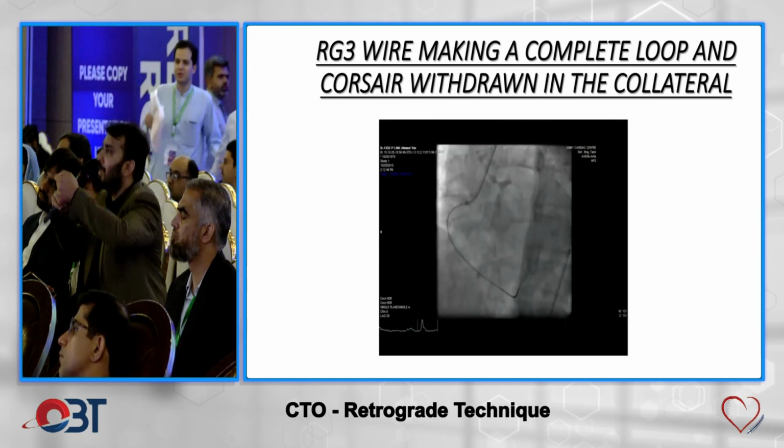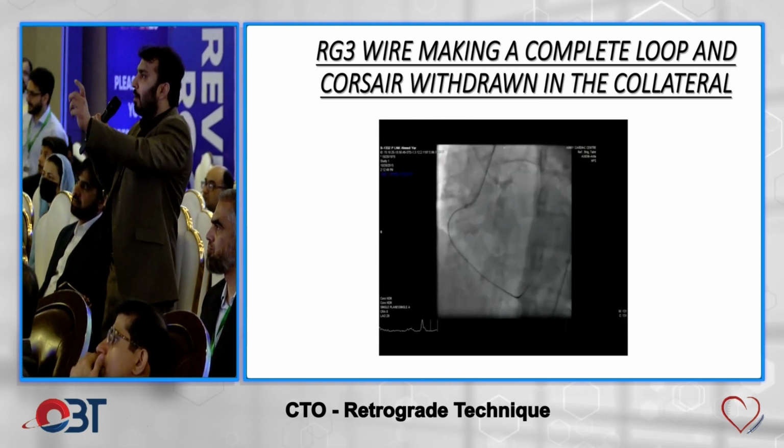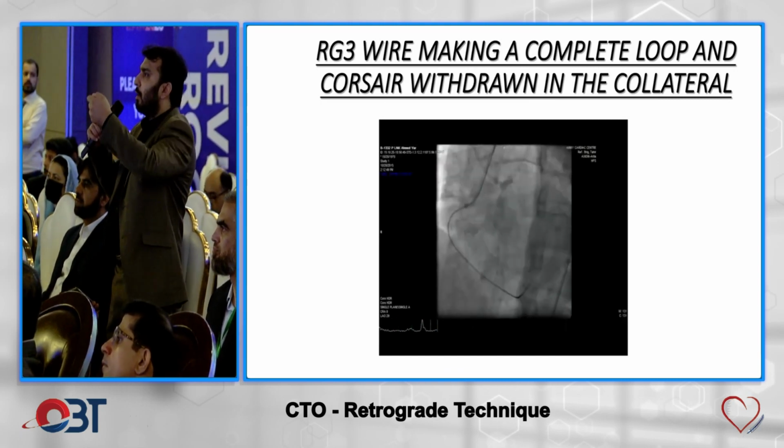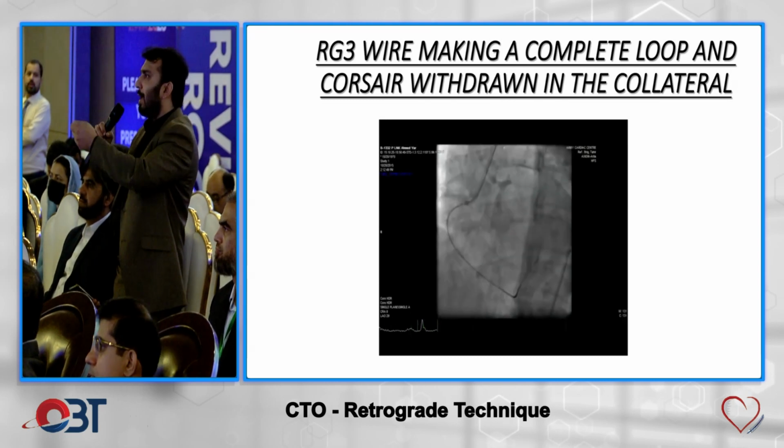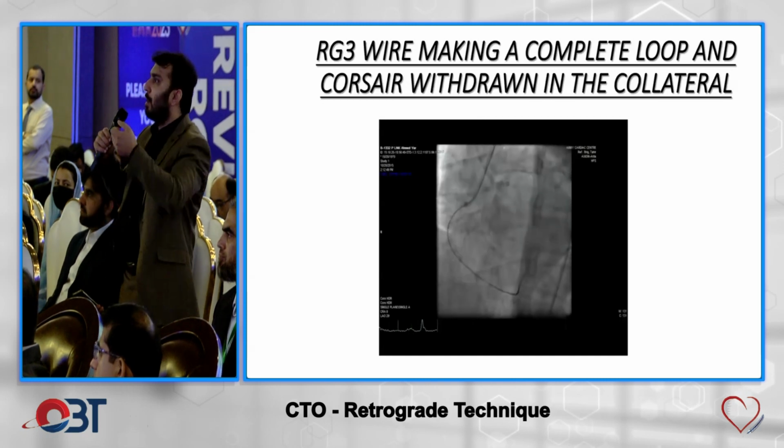But if we snare it without a microcatheter across the left main and proximal circumflex, an effect which is a cutting cheese effect, can it harm the patient? Where should the microcatheter be if we are snaring it with force?